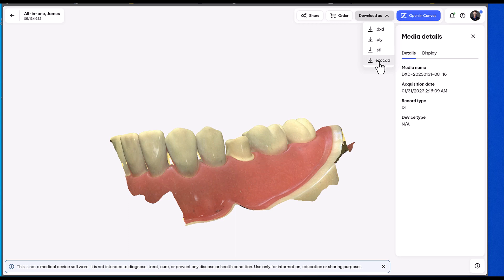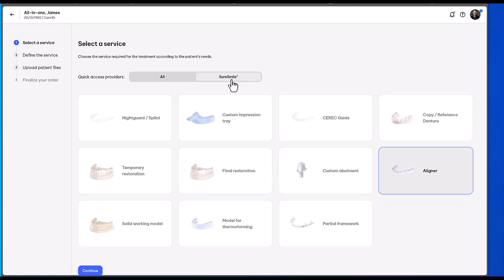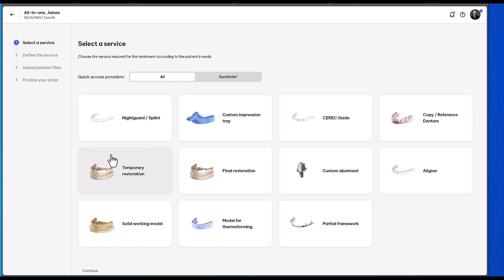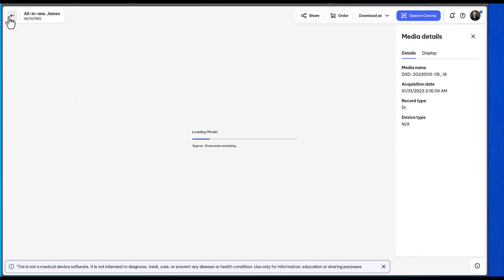We have the ability to download many different file types. You'll see even a direct export to ExoCAD and the ability to create an order. So very similar to the Connect Case Center, this is where you go in and select what you are trying to do. If it's not listed here, you can still share that file with a lab and give it a prescription of what you are wanting the lab to do for you.